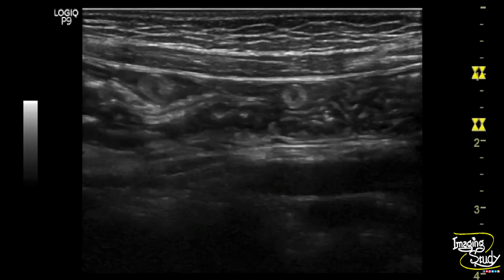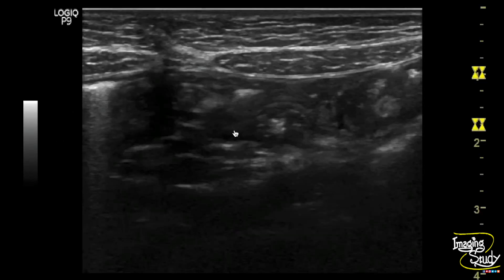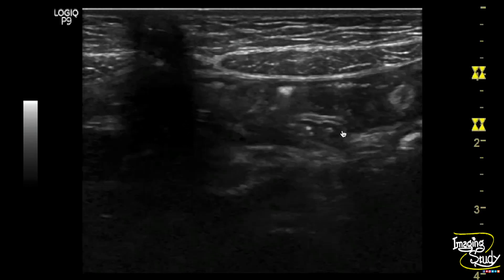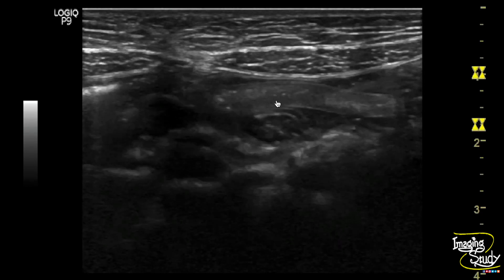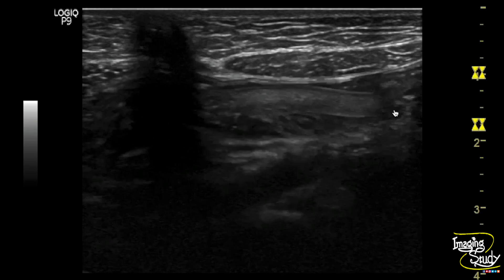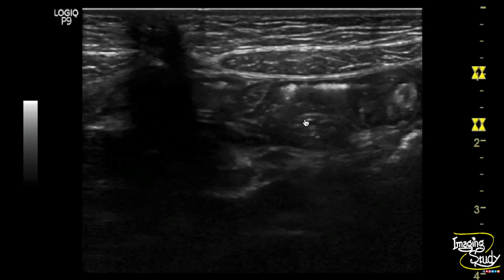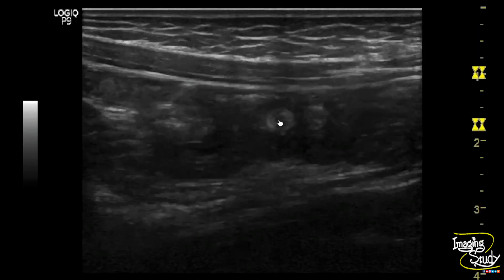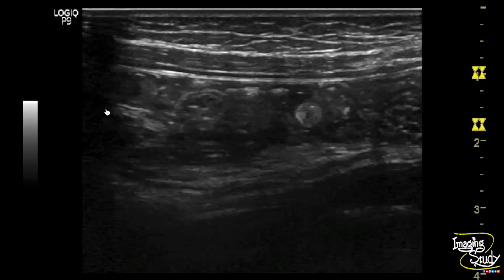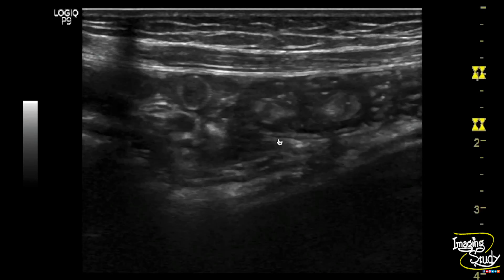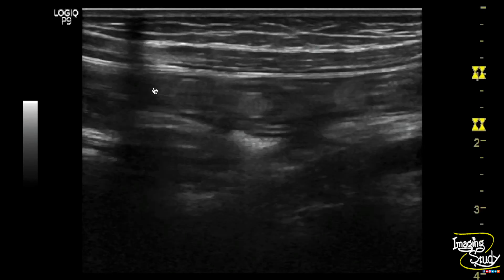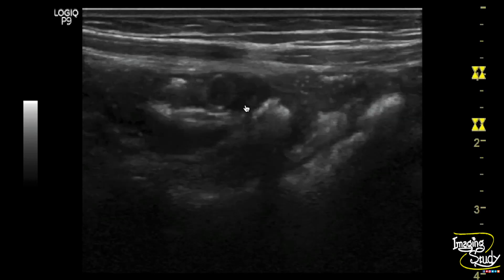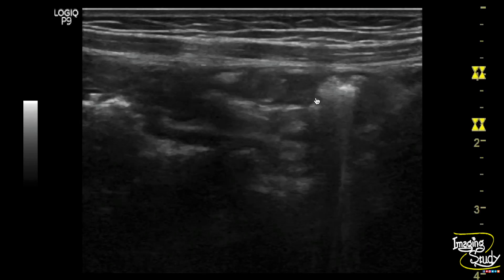Here you can see the high frequency linear transducer view. You can see multiple hyperechoic foci within the intestinal lumen. On long section you can see this motile structure within the small intestinal lumen. On transverse section you can see they are multiple in number. This hyperechoic linear tubular structure with slight motility indicates a case of intestinal ascariasis.